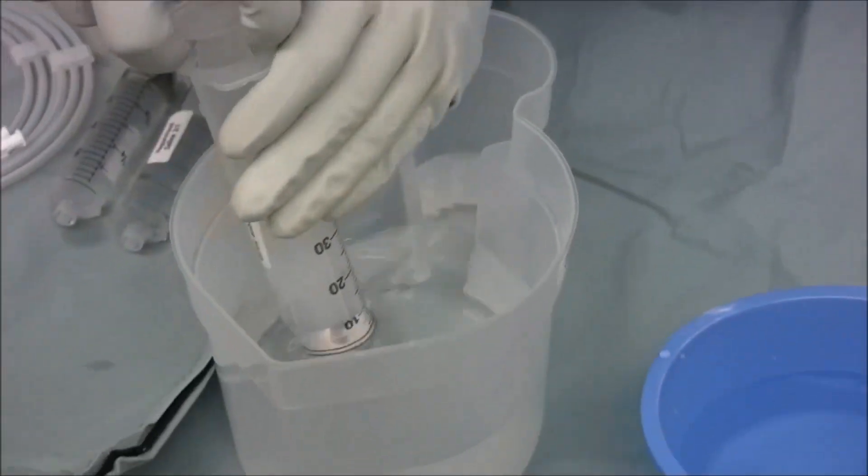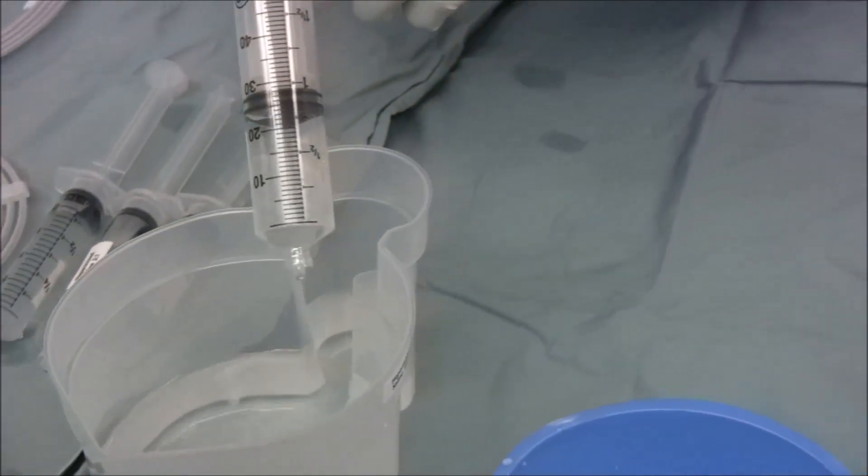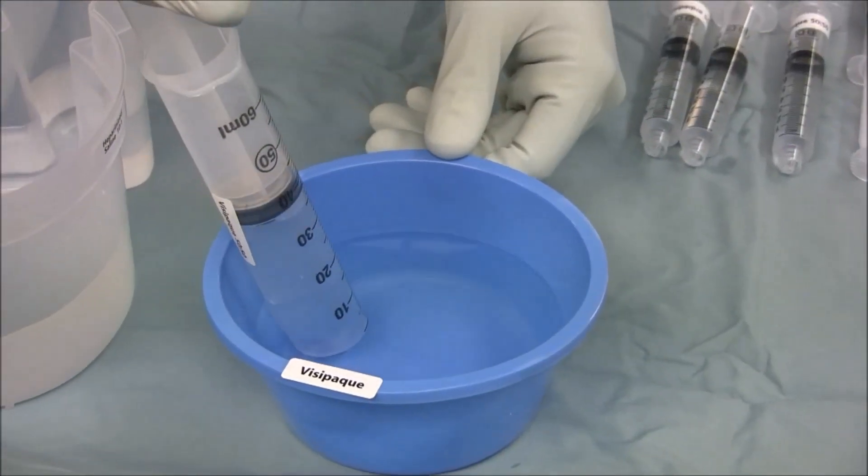A 60 cc syringe for the aortic occlusion balloon is also loaded with half saline and half Visipaque.